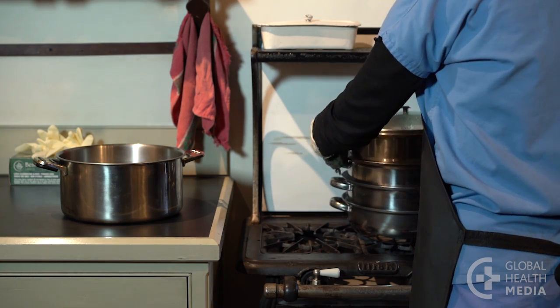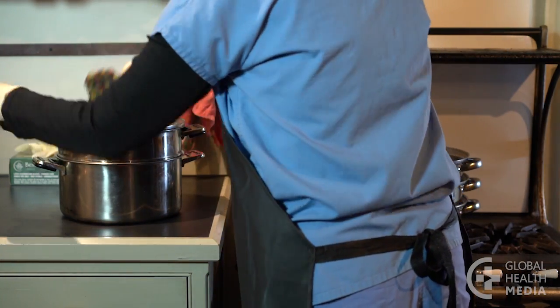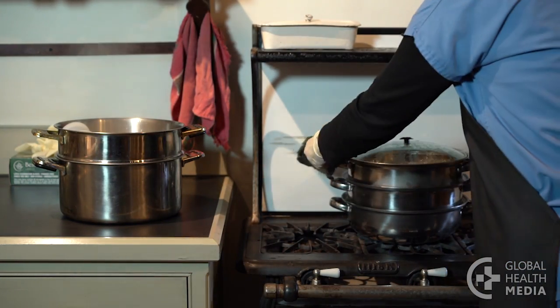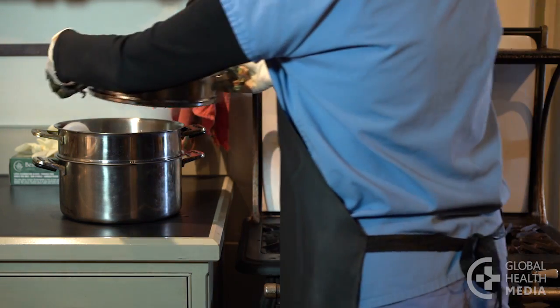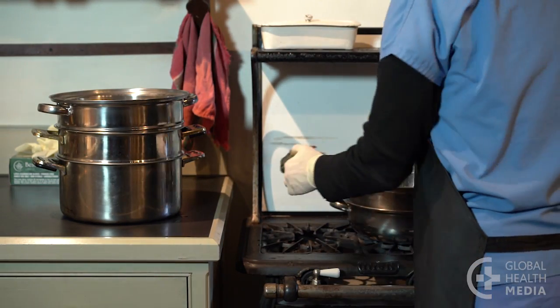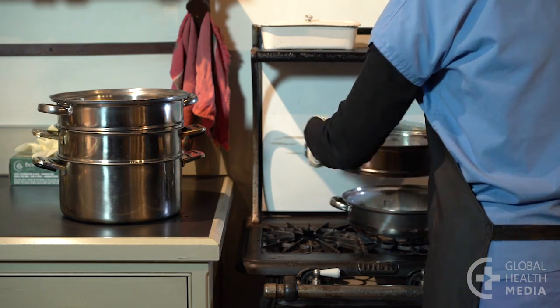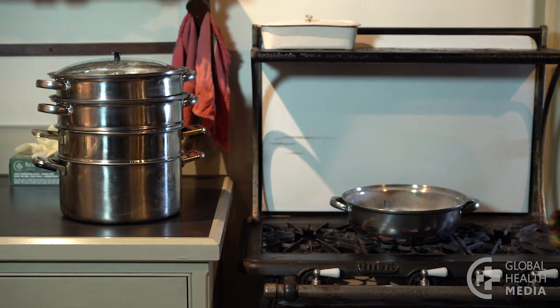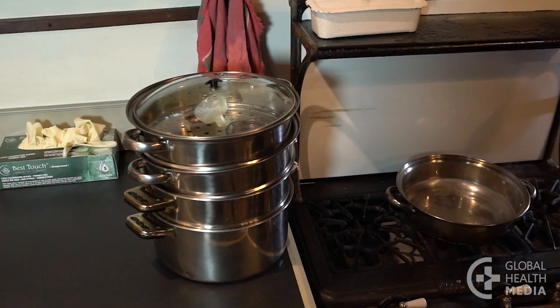Remove the steamer pans one-by-one, shaking off the excess water, and place them on an empty pan on the counter. Place the lid on top. Let the equipment air-dry in the steamer pans.